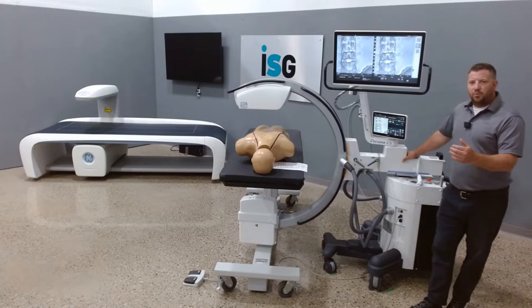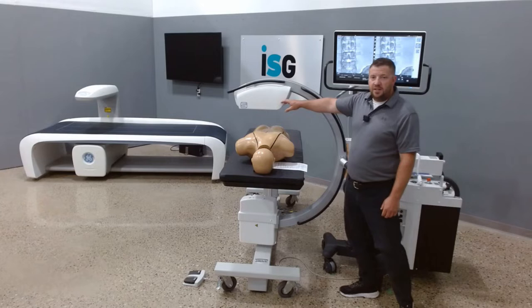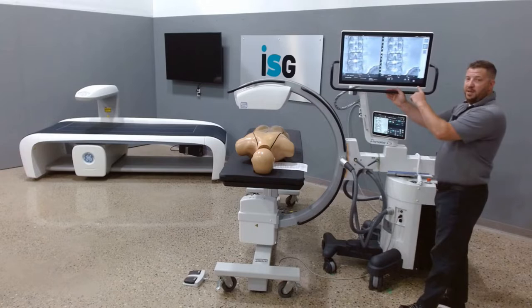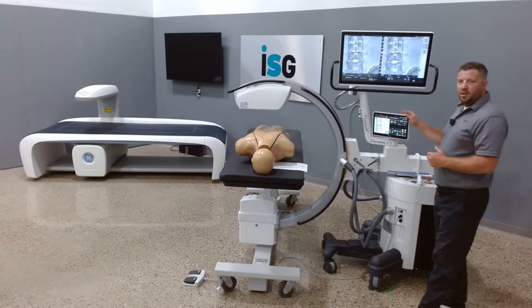First, I'd like to talk about the 5 kilowatt rotating generator, the 21 by 21 cesium flat panel DR panel, 27-inch 4MP monitor, and then the 10-inch swivel tech monitor. All adjustments can be done on this tech monitor — rotation, collimation — you can actually even draw, color, text, everything on this monitor itself.